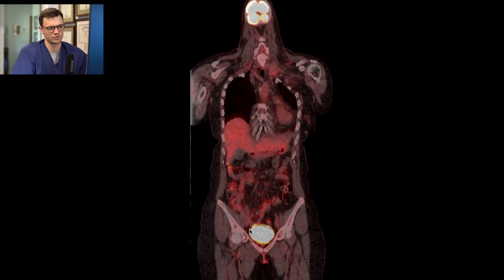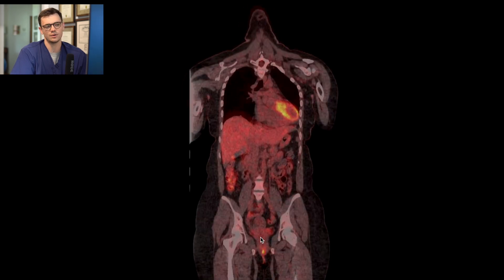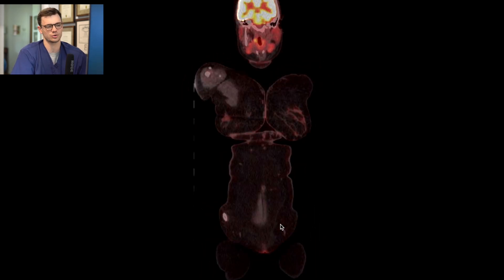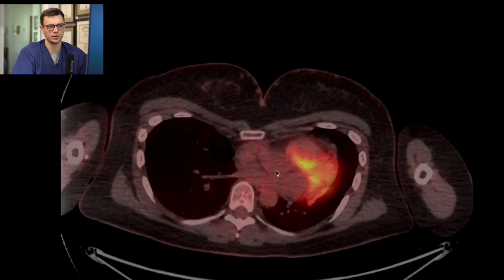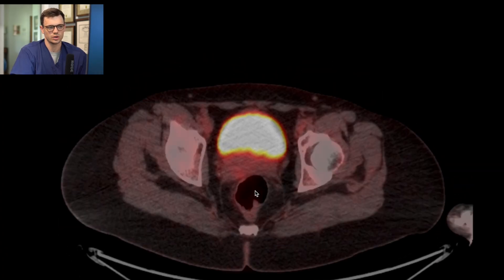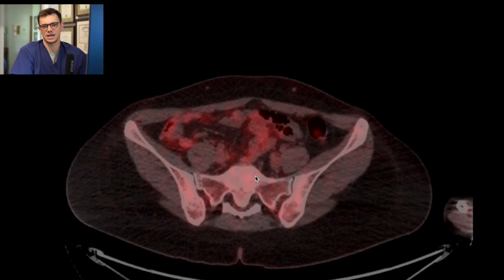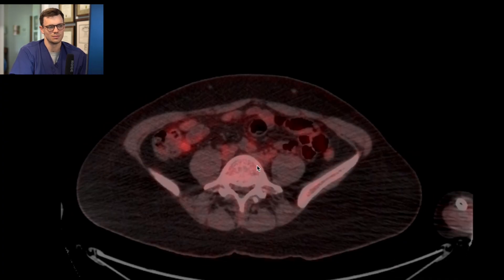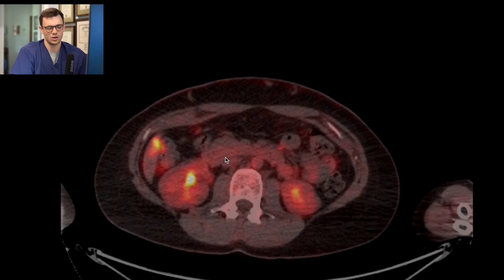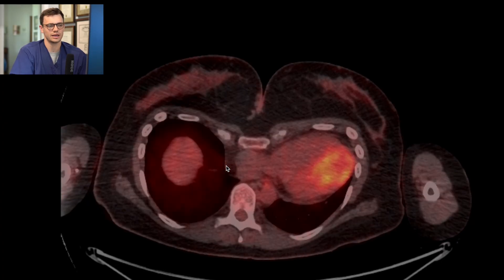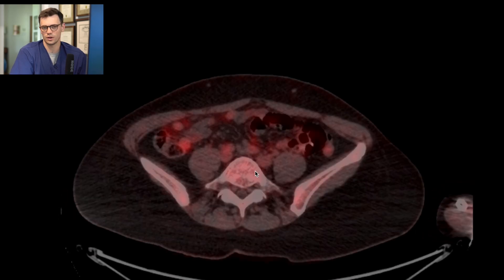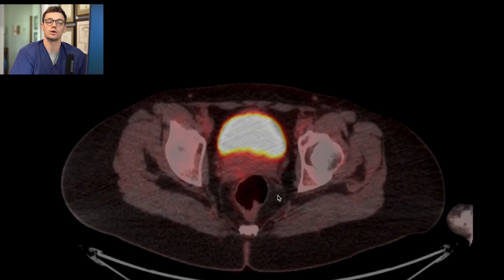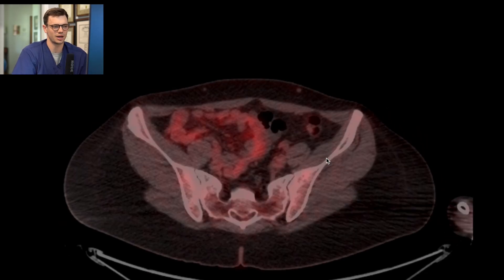I then go down to the bladder. The bladder has excreted tracer in it, so it's very bright. You can typically window on the software you use to read these studies. I always take a look in the bladder just to make sure I don't see anything beyond the excreted tracer — in this case that all looks normal. I then go back to the axials and pay attention to the bowel, going inferior and looking at the colon one spot at a time. Certain medications can cause increased activity in the colon — metformin is the classic one — but generally there can just be background activity in the bowel. You're looking for something focally hot, outside of background activity. A tumor of the colon can be a focal hot spot you'd want to bring up. In this case, looking at the bowel, everything looks okay.